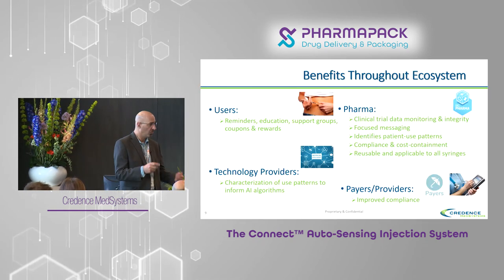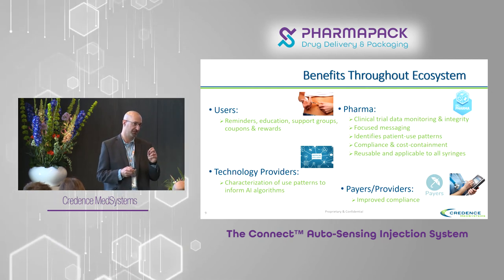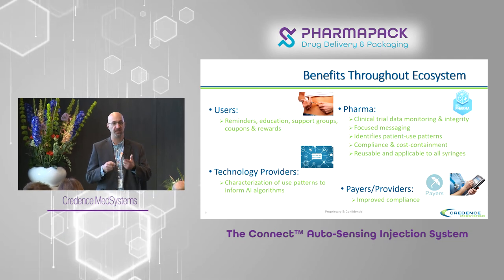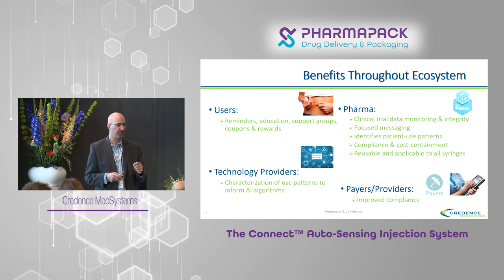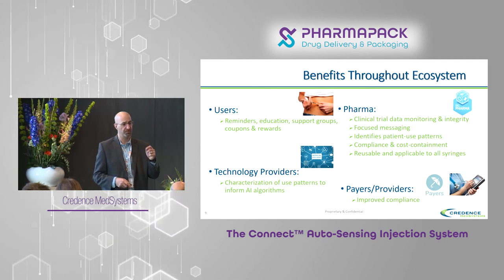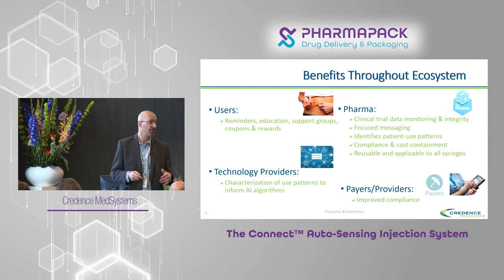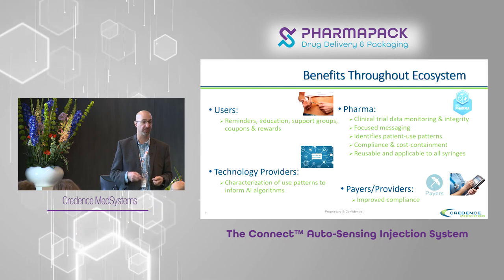So where do we go with this? Why is it important? It's important probably in the immediate short term to enable informed safety and efficacy data in your clinical applications. If a pharma can know whether their patient or clinical subject has injected properly according to the dose regimen or not, they can have informed inclusion, exclusion criteria discussions with regulatory bodies. So their data is more robust, and it's done by remote sensing. It also drives down the CRO costs associated with all the monitoring and the paperwork.